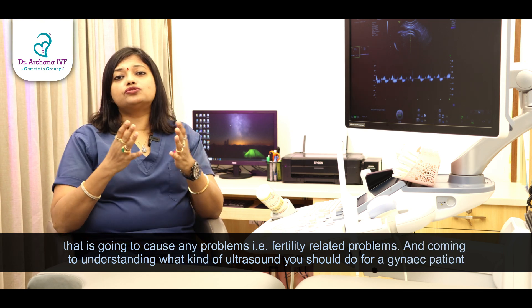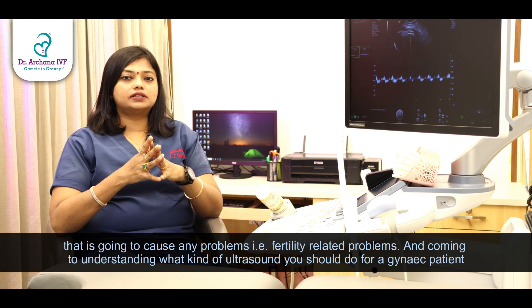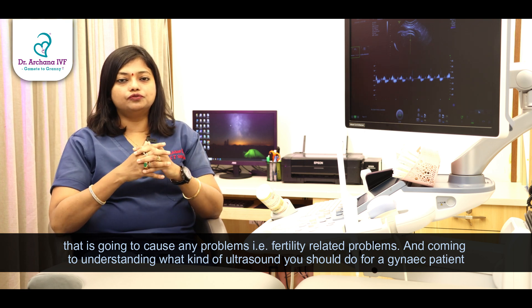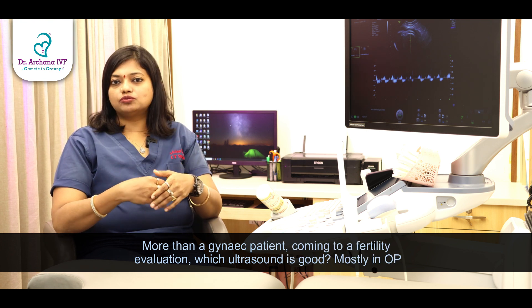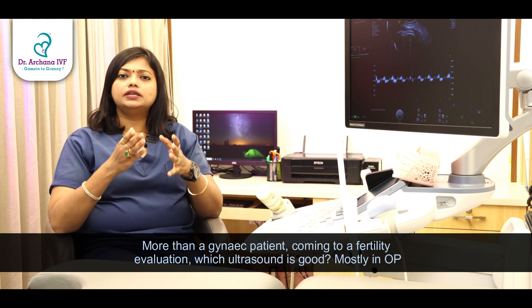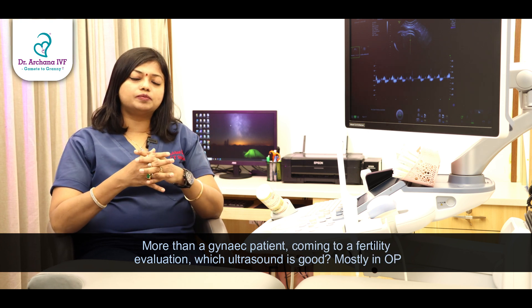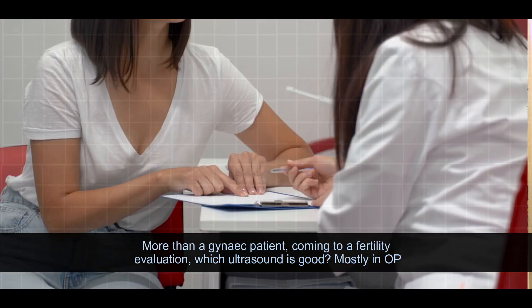Now, coming to understanding what kind of ultrasound you should do for a gynec patient — that is, a gynec patient coming for a fertility evaluation — what kind of ultrasound scan should be done?